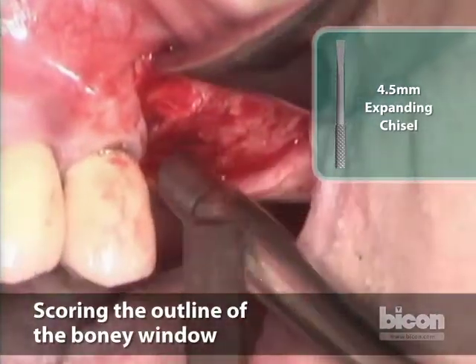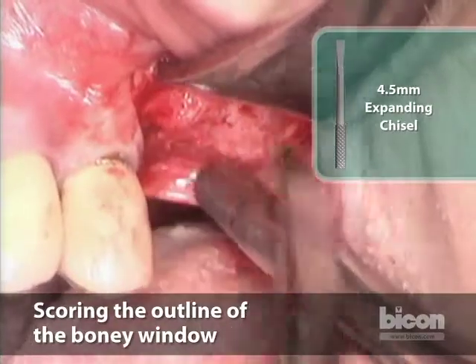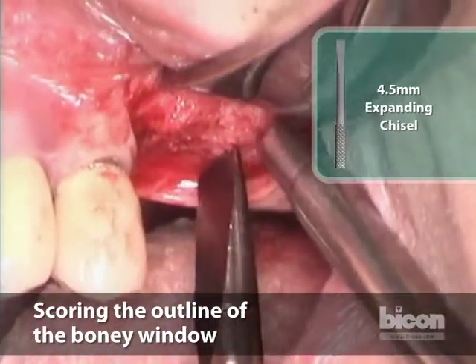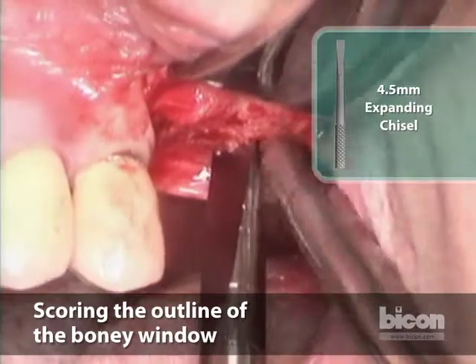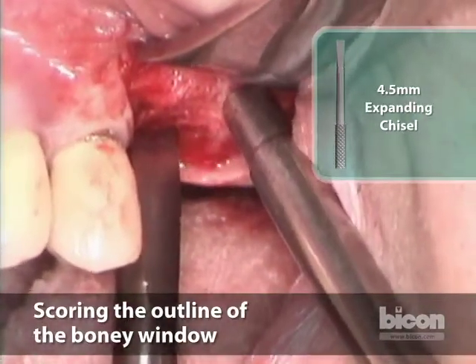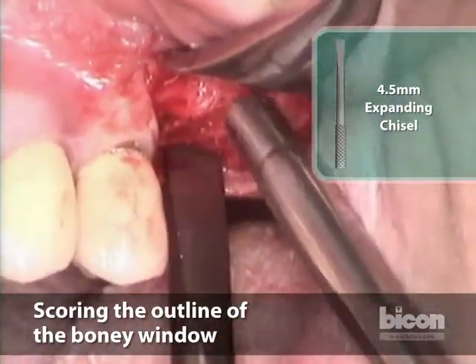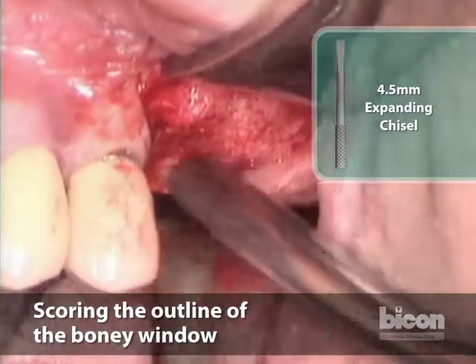You only need to score it — I don't need to cut it. We're scoring that rectangle; you can see the corner here has been joined. For both, we need to do the palatal end now. A very small window indeed, but it's going to allow us to mobilize the floor of the sinus with full view, which will then work to permit the placement of the implant.